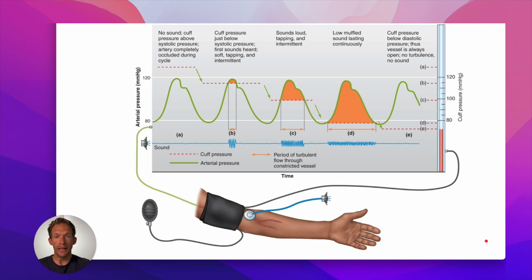You take the left arm and you make sure that your patient is completely relaxed, sitting in a chair with the arm actually supported in order for no muscle activity to be present that could, for example, impact the reading of the pressure. If you imagine someone is moving his arm or he's talking or he's doing other movements, it might potentially create additional muscular pressure that will be added to the real blood pressure that you are trying to measure. So normally you want to make sure that your patient is seated with the arm rested on the table, for example, or on the armrest.